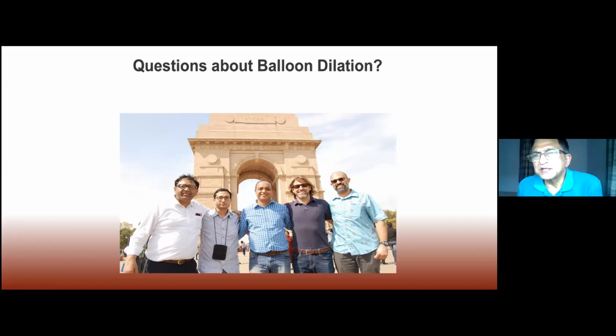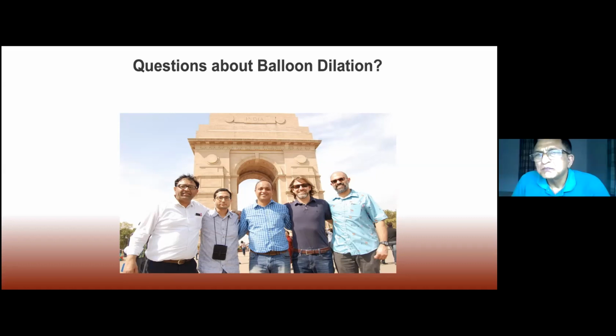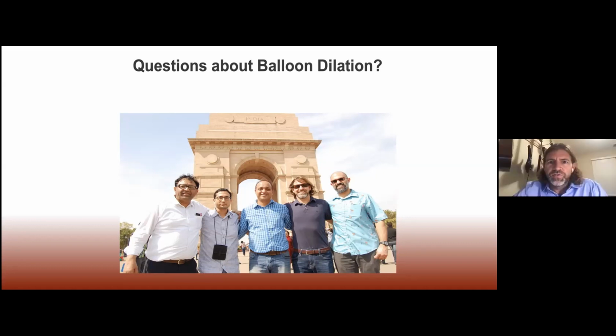Doug, you've dilated the case for the first time, and after that, there are some early indications that it is not going to work. What are those that come to your mind? So I think patients who have a significant amount of edema in the glottis and subglottis are very tricky to manage with a balloon, because you dilate the balloon and it really just bogs back in on you. Those are trickier than patients who have a more established scar, albeit possibly thin.